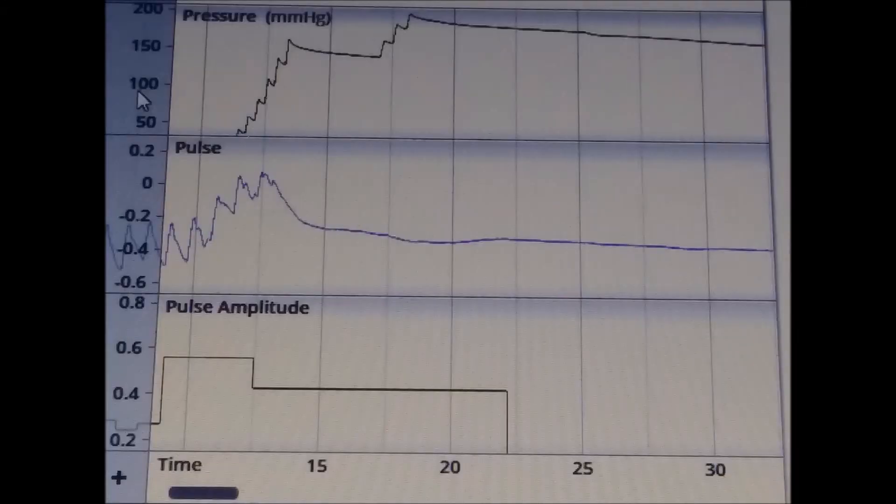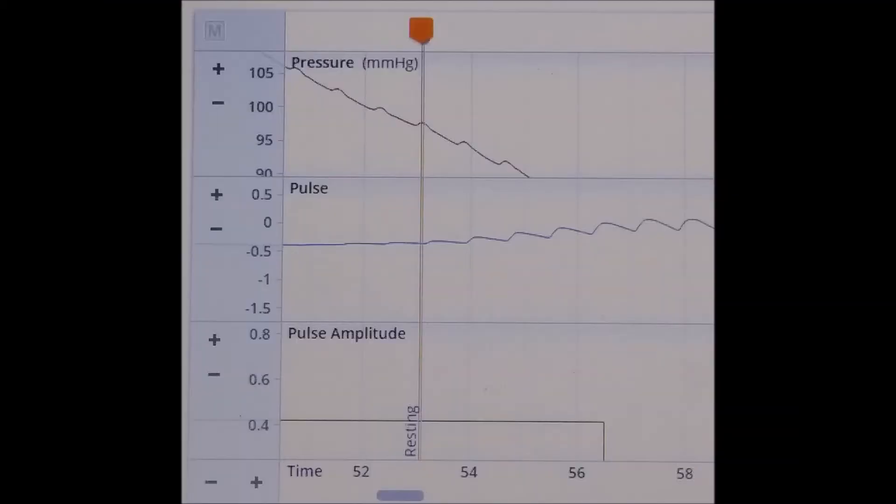Have patient begin in a resting position. Press start and inflate the blood pressure cuff until it is above the systolic pressure. At this time, you should notice that the trace in the pulse window goes flat. Keep deflating the blood pressure cuff until the signal in the pulse window is regained. Reappearance of the pulse signal signifies the systolic pressure. Use the marker tool and follow the vertical line to find the corresponding systolic pressure.